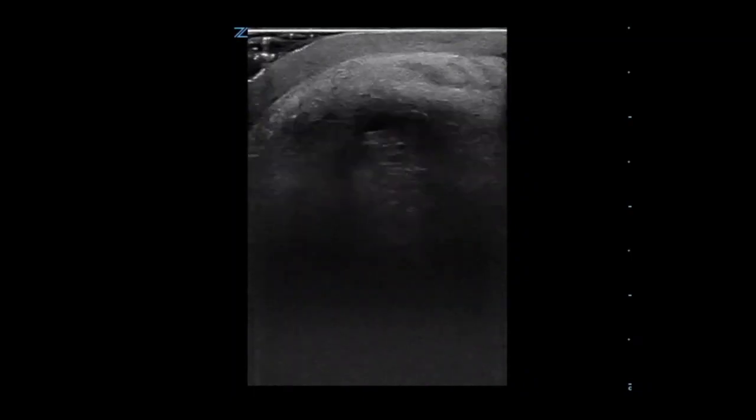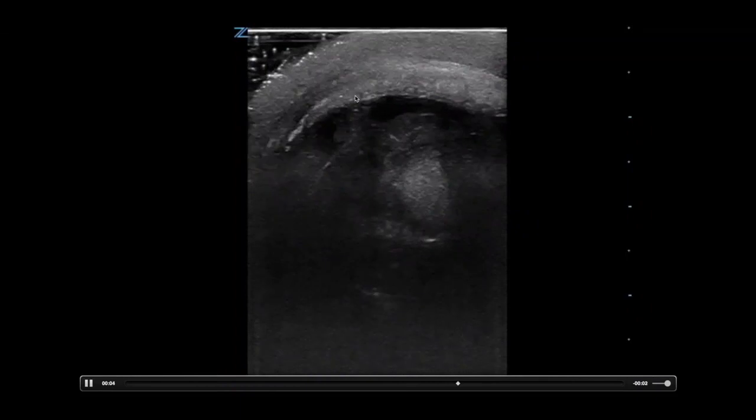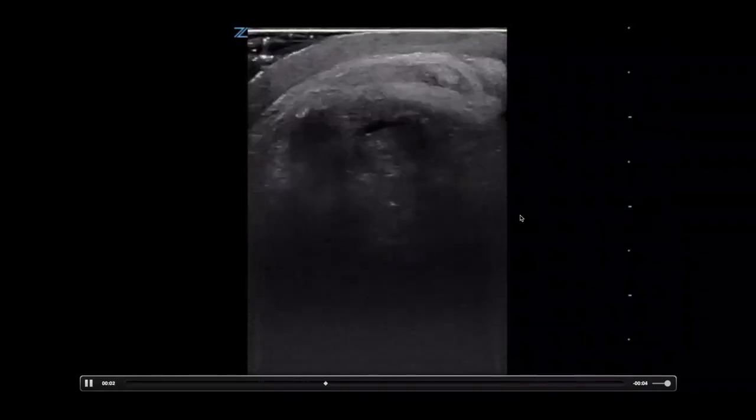So we'll finish up with a couple other things. We're almost done here. This is a patient that I saw in residency, who had an object come through a windshield, and clearly we couldn't see their eye. We have lots of gel here. They have a very swollen lid, and there's so much material in here we can't really make out the eye. This is a pretty good sign this person has a ruptured globe. So this was pretty much the only image you would get. Clearly this is indicative of a globe rupture and an emergent ophthalmology consult.